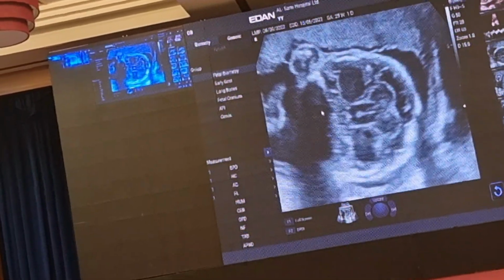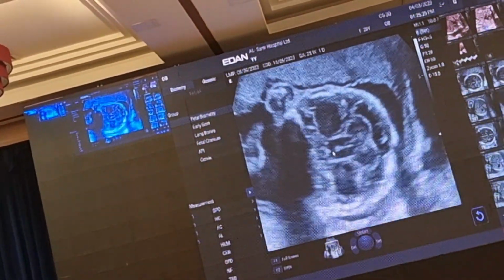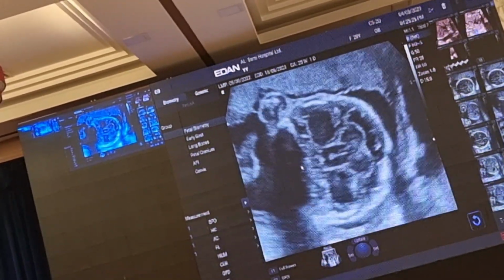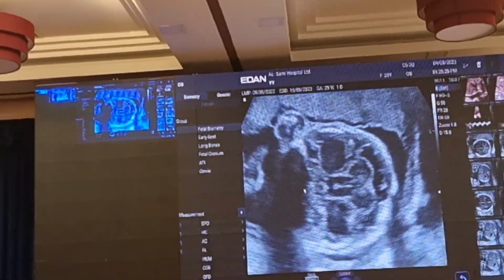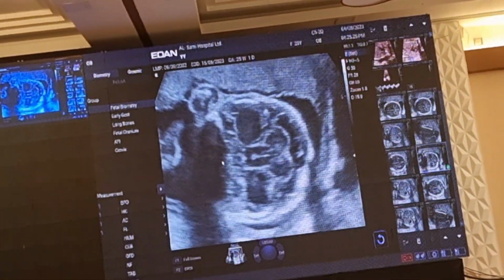Now of course here we took them in a hurry, but in each section, that is the lateral ventricle view, the transthalamic view and the posterior fossa view, we should see the CSP in all three sections. These are the three basic views which are used for neurosonogram. And if there is a problem, then we do an extended neurosonogram where we look at coronal and sagittal sections.